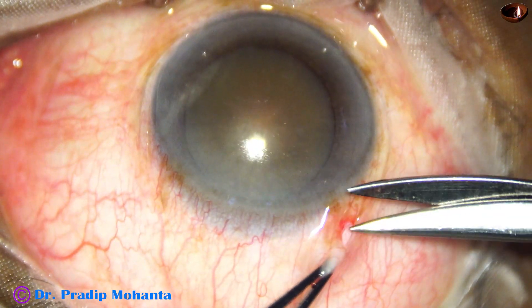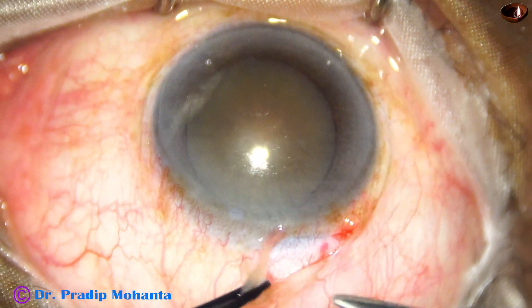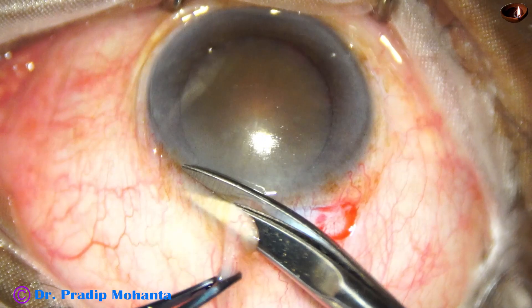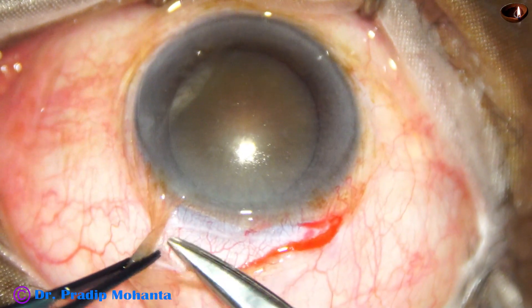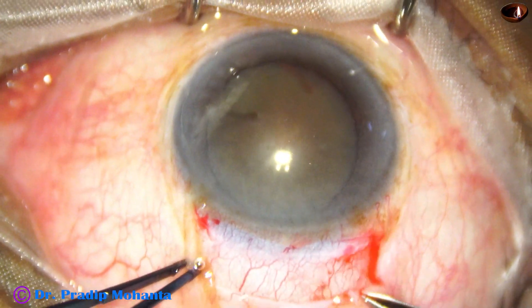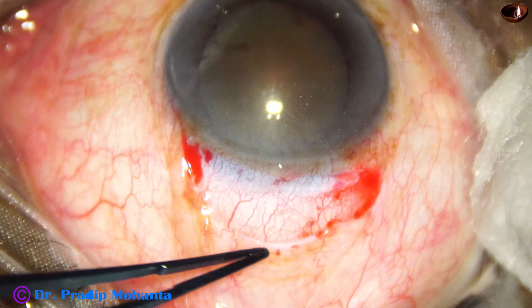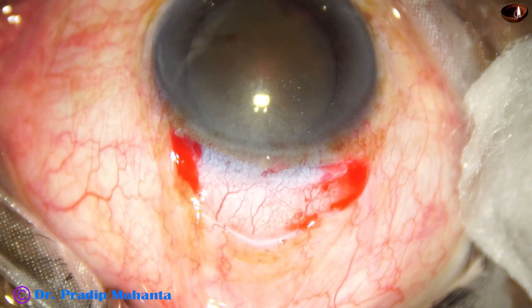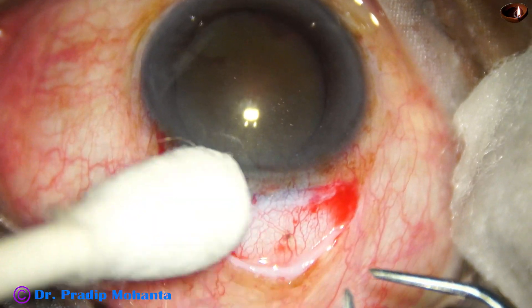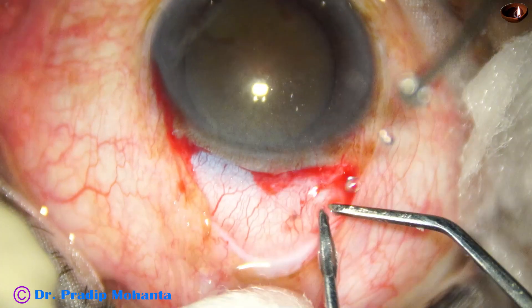See the cataract — it is a brown cataract. Nuclear sclerosis is about grade 5, and this is an ideal case for SICS. We can do FACO in such cases; I can do FACO with my submarine chop technique, but there are thousands of ophthalmologists around the world who will find it safer to do SICS in such cases.